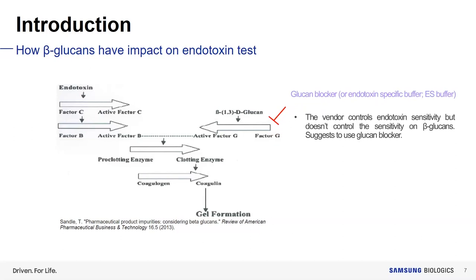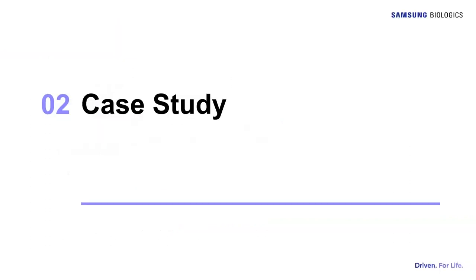Vendors of LAL solutions suggest using a glucan blocker or endotoxin-specific buffer — ES buffer — to block beta-glucan interference. Many drug manufacturers, including Samsung Biologics, use a glucan blocker if required. At Samsung Biologics, we have a qualification process for endotoxin tests at each sampling point. During early manufacturing and qualification, we conduct studies to decide whether a glucan blocker is required. After qualification, we use or don't use the glucan blocker based on those results unless a process change may impact beta-glucan levels.